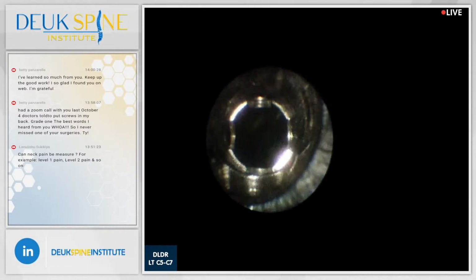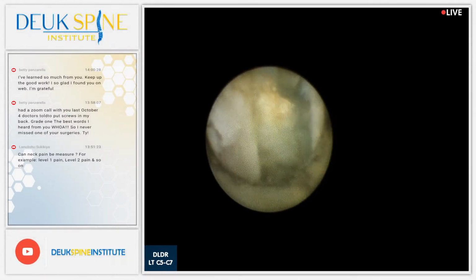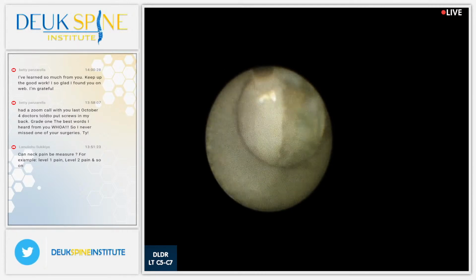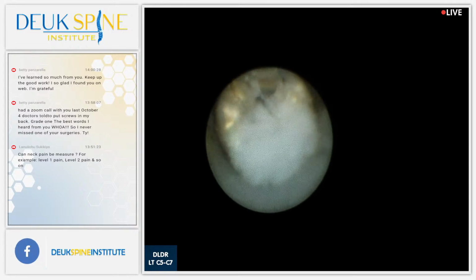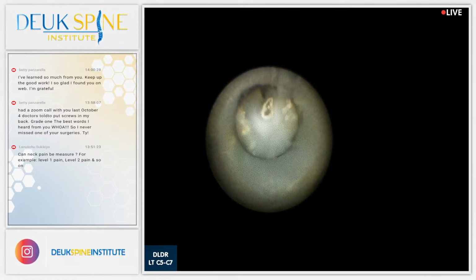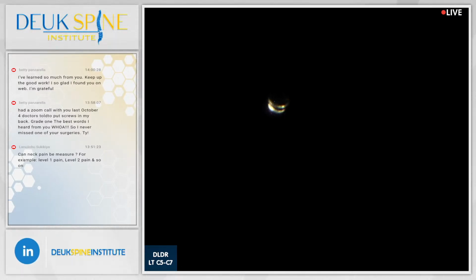Ah, come on. These pieces of disc just drive me crazy. I waste my time. Little pieces. They all want attention. Take me out. Take me out. You're small. Take me out. I will block you. There's a big piece of herniation right there. I will block your view until you're forced to deal with me. It's like a really bad girlfriend. Right? Or ex-wife, which I don't have, by the way.